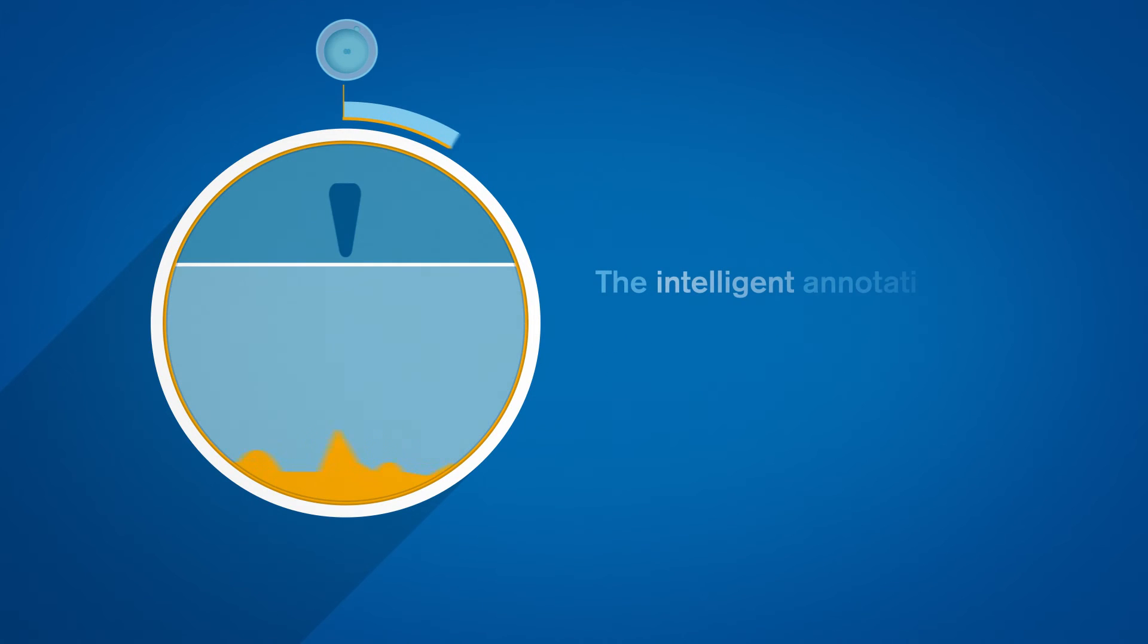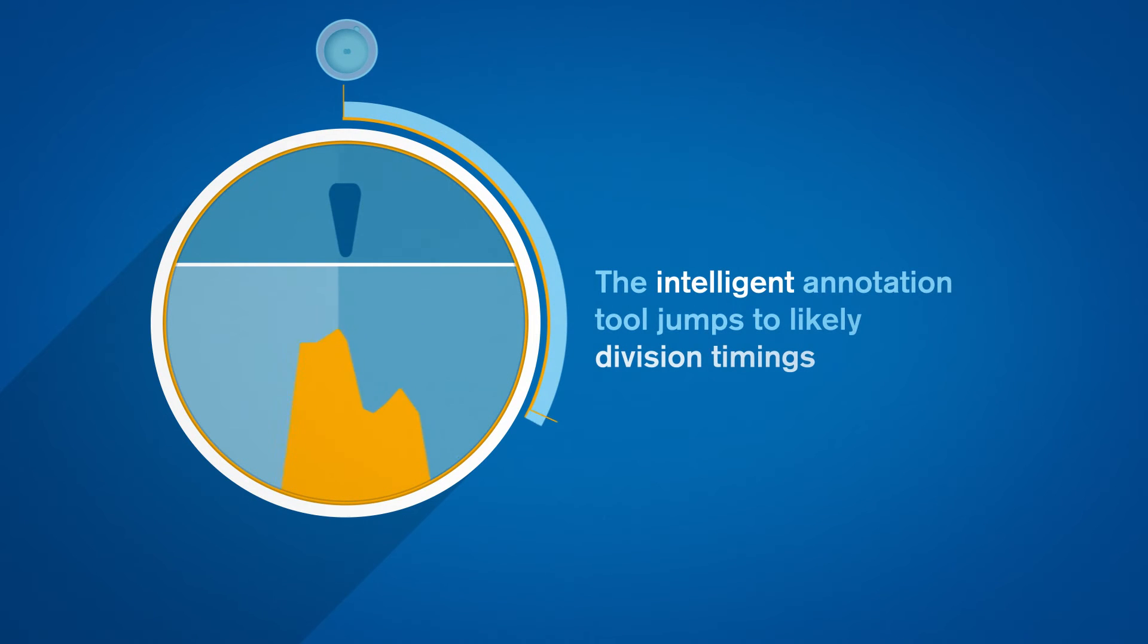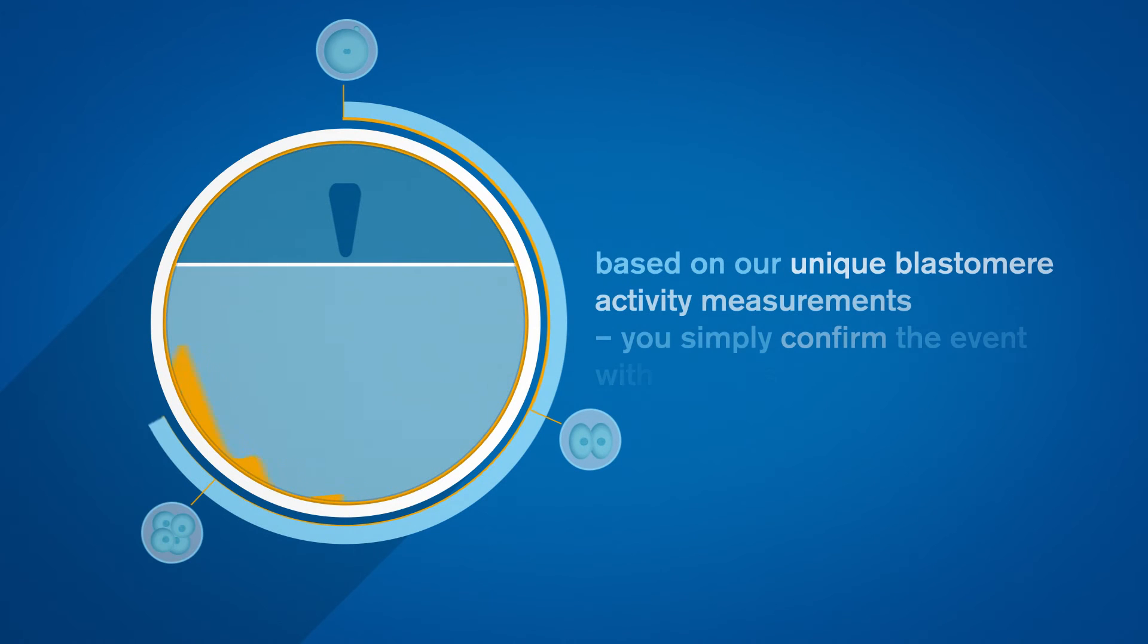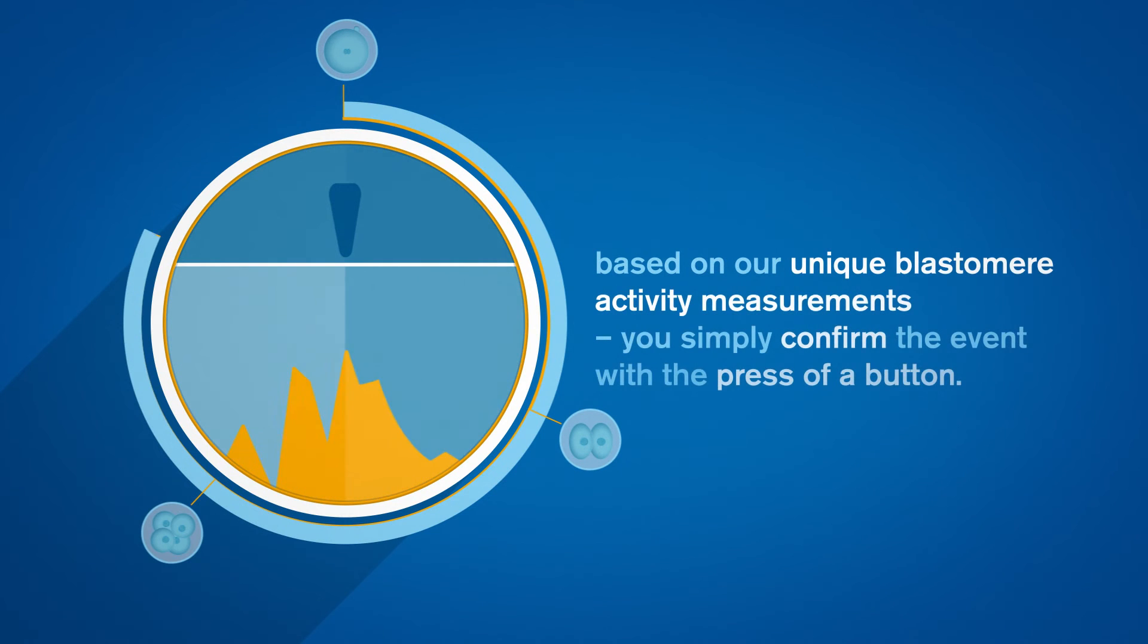The intelligent annotation tool jumps to likely division timings based on our unique Blastomere activity measurements. You simply confirm the event with the press of a button.